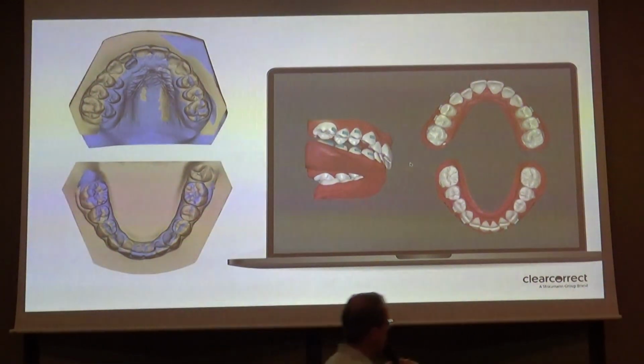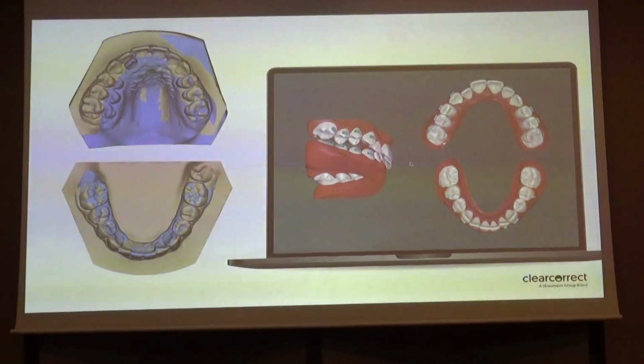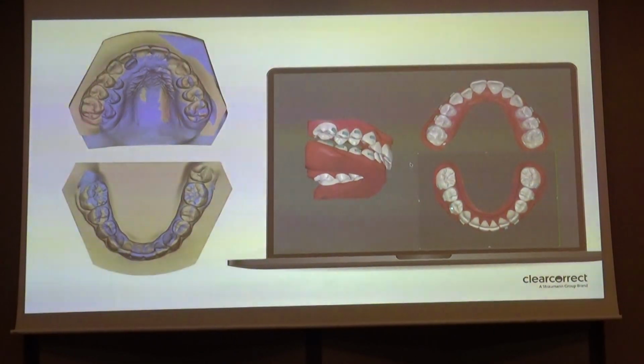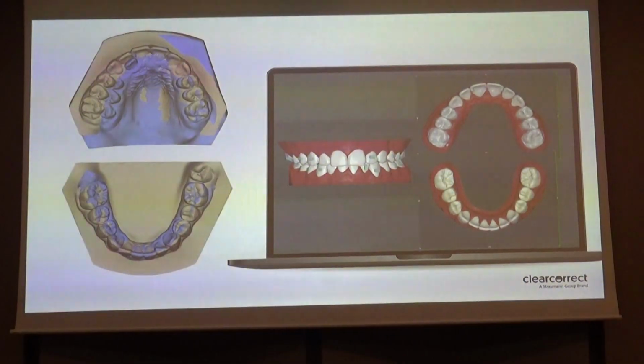Let's check here if you can play the setup. Okay, expansion of the lower, and contraction of the upper. And this is the reason why you are seeing the engagers there.